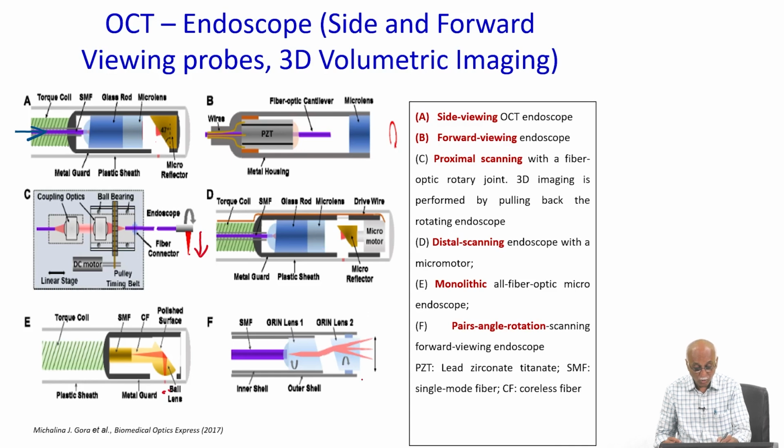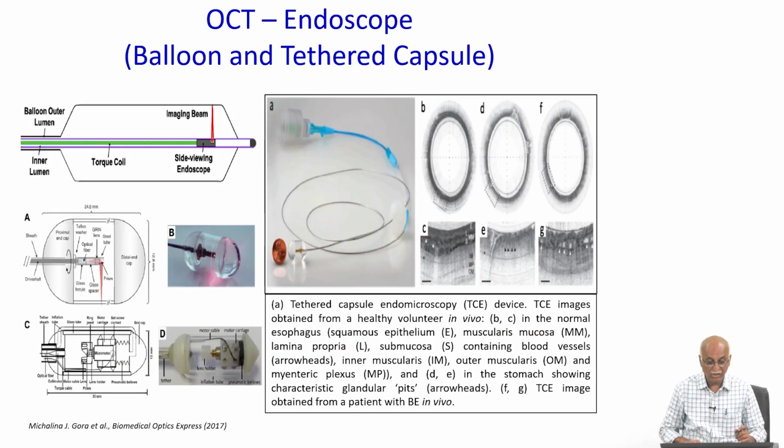So, by rotating this lens, the position will be different, and accordingly it can allow scanning across this. Such different ideas can rotate the beam, and side exposure can be achieved with this, and the reflected signal couples back for our OCT application through this optical path. This approach allows us volumetric imaging or circular, peripheral imaging of the vessels, etc.